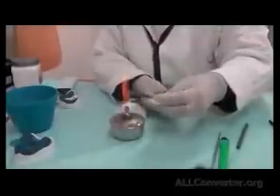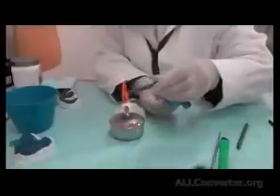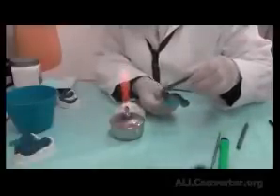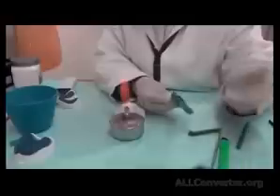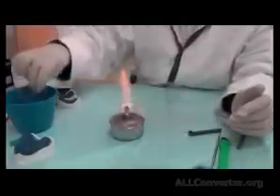Continuing with the other side. If it stops sticking, I stop adding. I need it to stick totally. So it is sticking. I add until I have added a bulk of material. And even if it's irregular, let's suppose you have done it like this, as most students do, very irregular, put it in warm water.